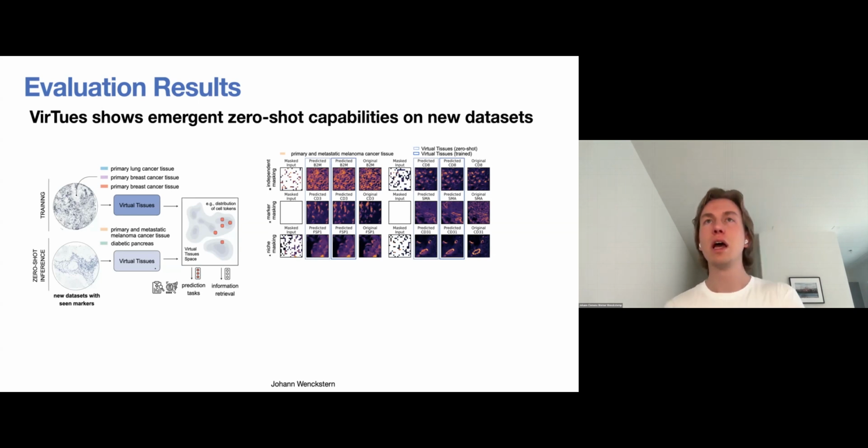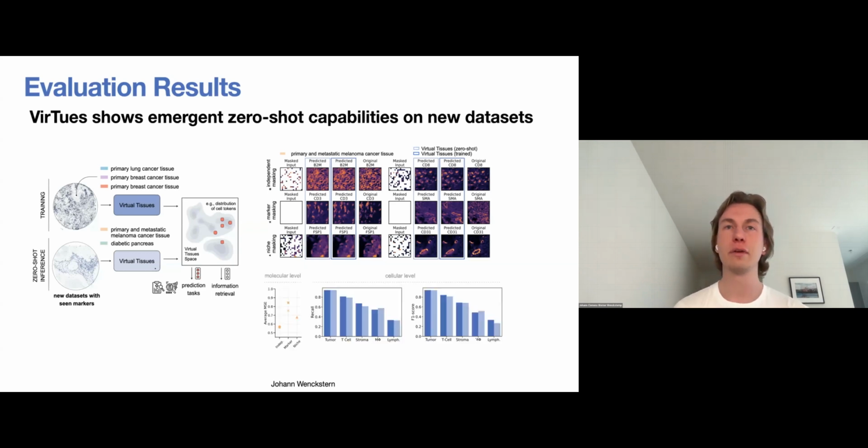Looking at the reconstructions, we see that the model is able to, again, reconstruct the tissue at a high fidelity. It accurately reconstructs both single cell structures and single cell expression, high intensity expressions, as well as global structures, and this across all 3 different masking modes. The difference between zero-shot and trained in terms of quality of reconstructions is relatively small. Looking at the reconstruction loss, this confirms the qualitative impression, that the reconstruction difference is small between trained and zero-shot evaluation.